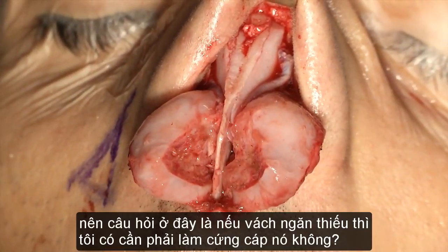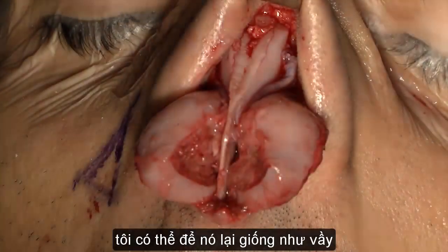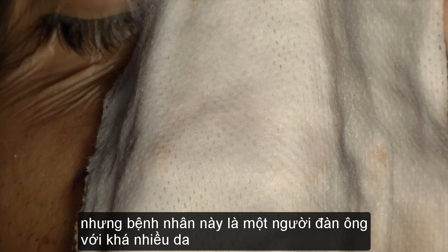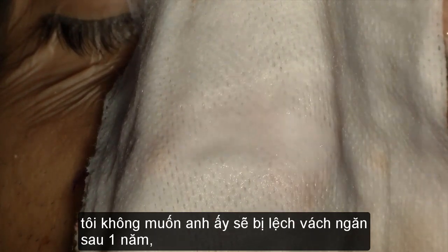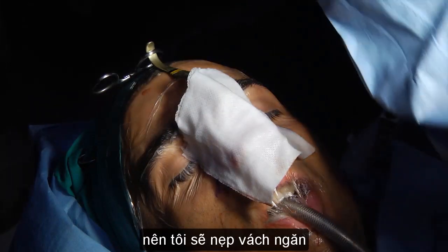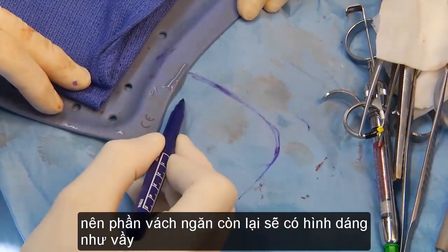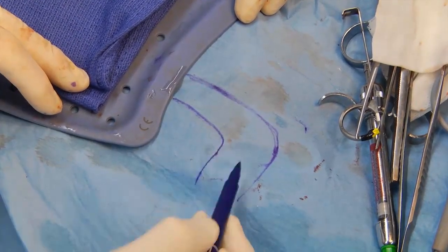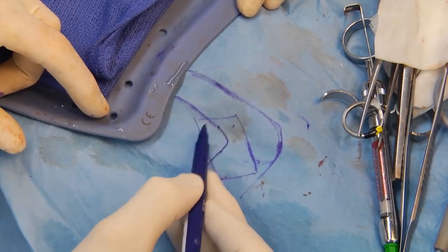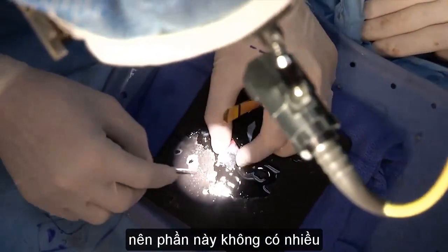My rationale here is: is this septum decent? Do I need to stiffen it? Possibly I could leave it like this, but this fellow is a male with a lot of skin. I don't want him to deviate in a year or so, so I will splint him. So my L strut is shaped like this. This is kind of weak, so we will put a plate like that.